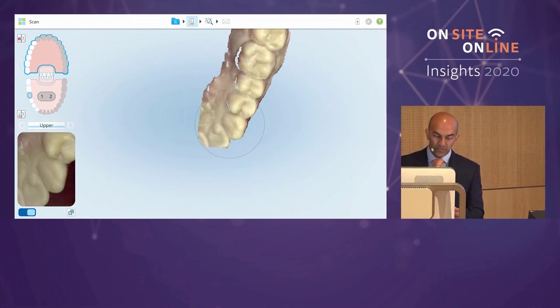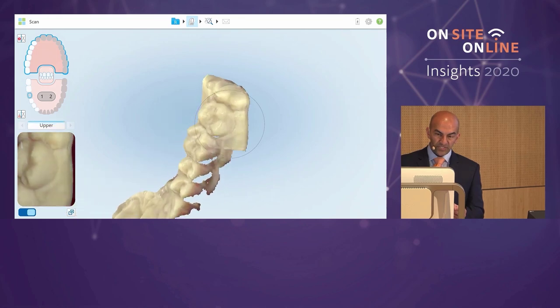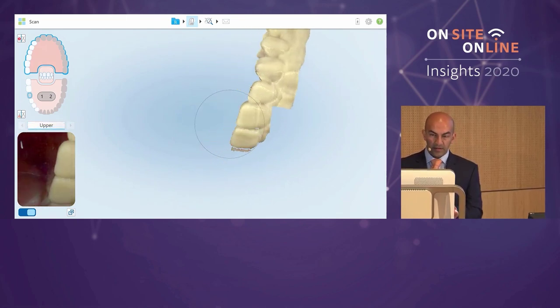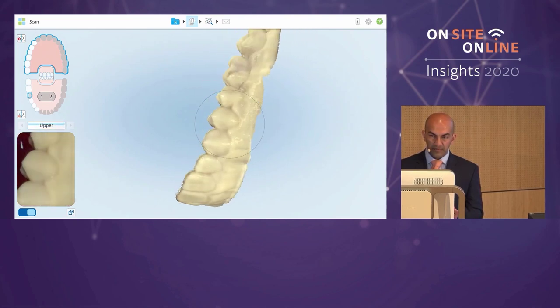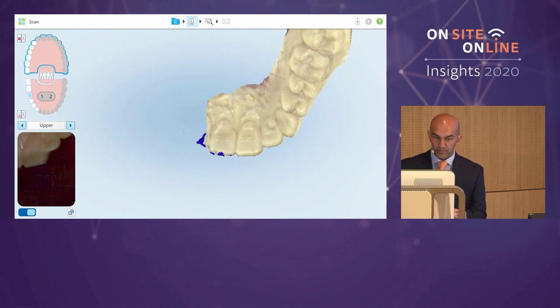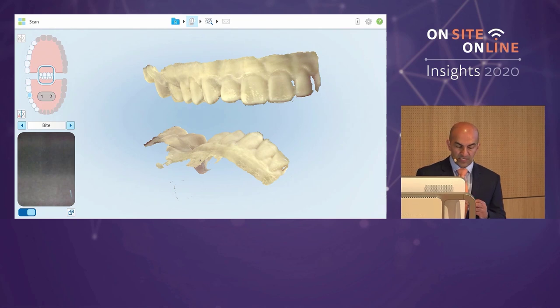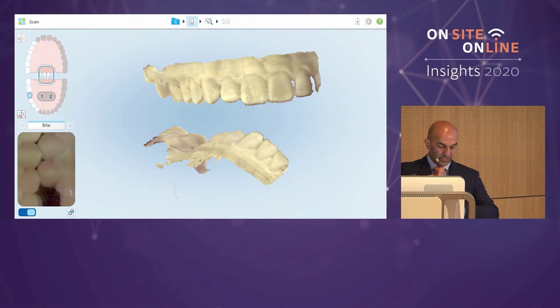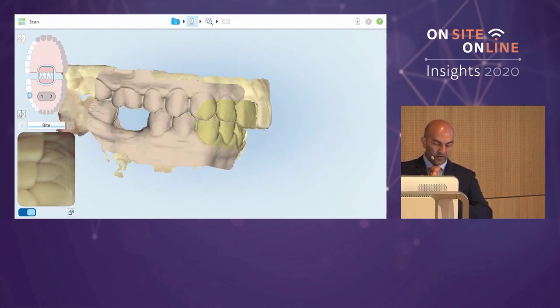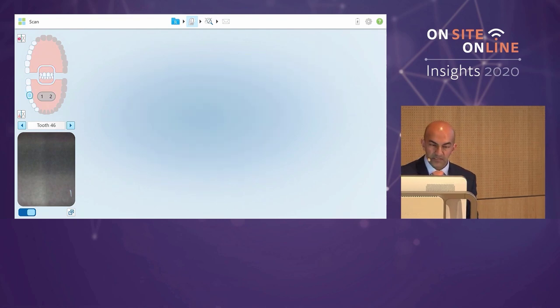Even though that wasn't a particularly sparse scan, it's a lot quicker than mixing material, loading an impression tray, and putting it in a patient's mouth. Most patients would be very happy to have a scan rather than an impression. After scanning the opposing arch, it asks for a bite registration — we get the patient to close into intercuspal position and do the buccal bite registration. The purple coloration confirms it has matched the upper and lower together.